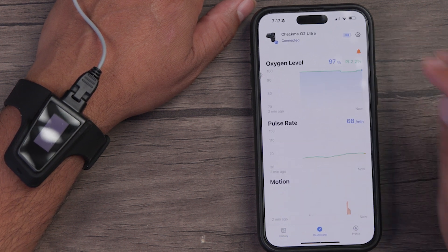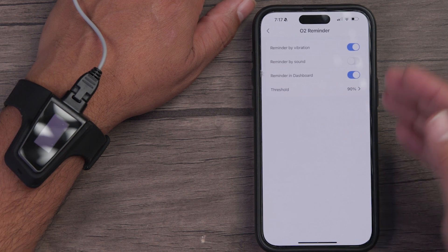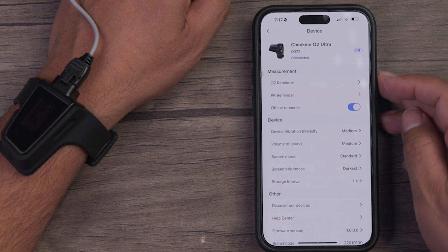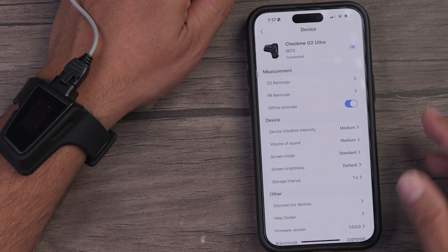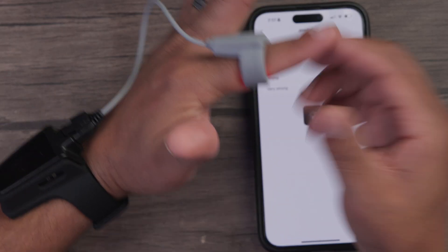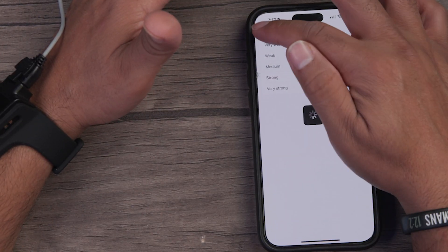You can also set up when you want the alerts to go off. You have your O2 reminder — you can choose vibration or sound and set the threshold, which we have at 90%. Your pulse rate reminder can also have those parameters set. You can adjust the vibration intensity as well. If I set it to very strong, it's buzzing right now, so if I fall short on one of those parameters, it'll remind me through that buzz.